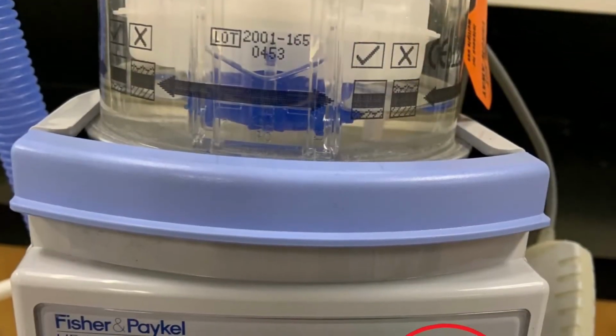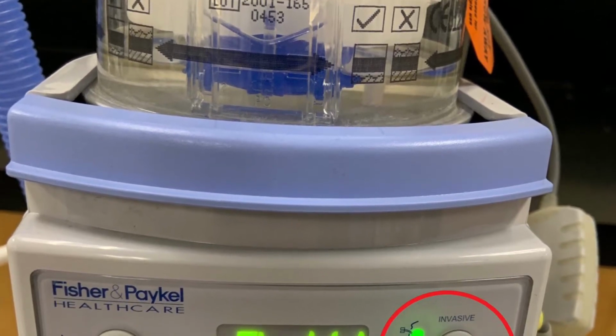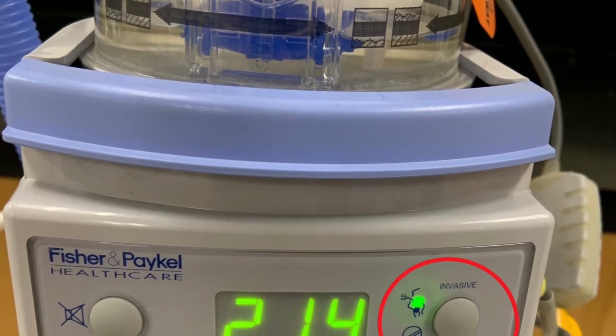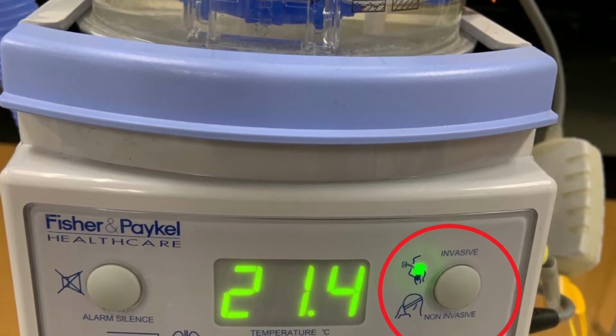Gas flows from the Max Venturi blender to the heated humidifier. You choose whether you're going to use this on an intubated or non-intubated patient. The temperature is set by pressing the button that is in the red circle.